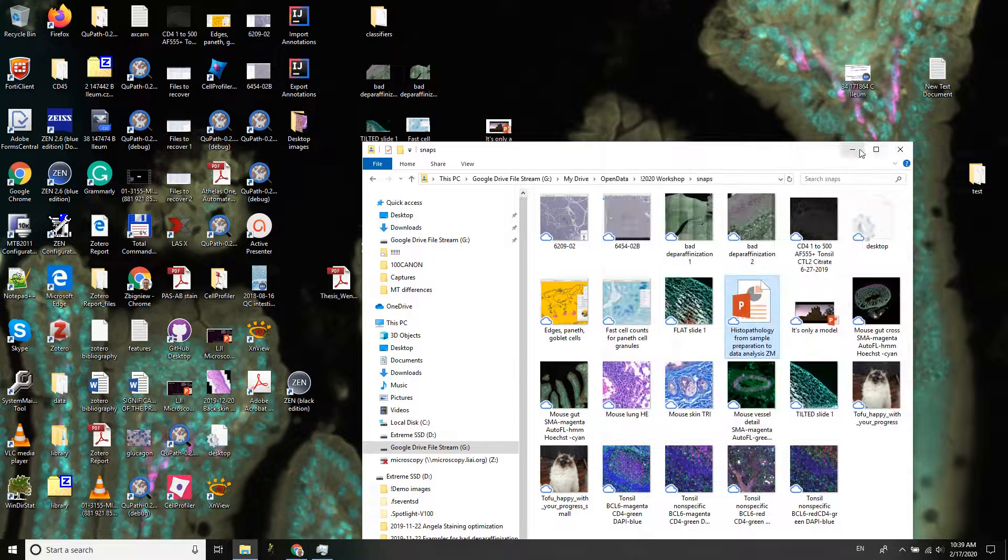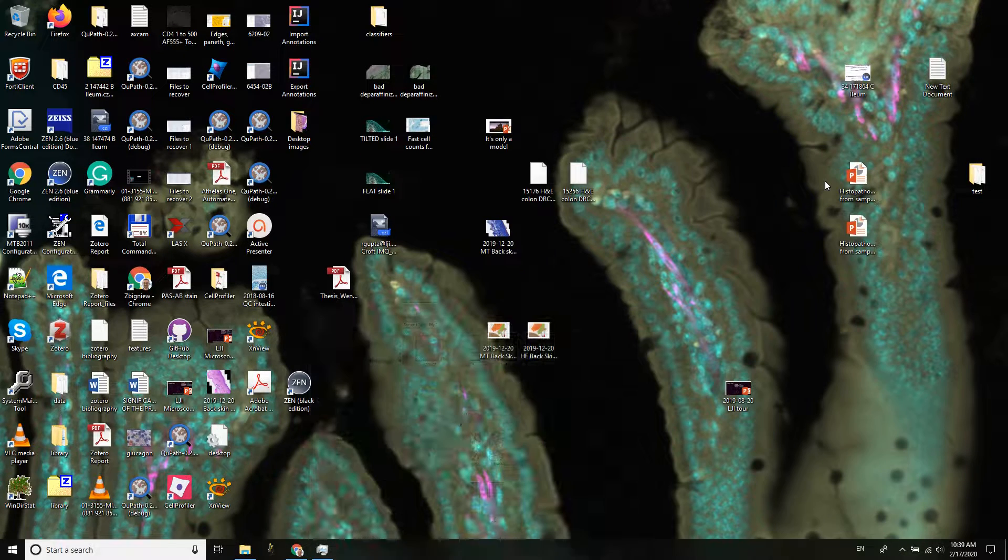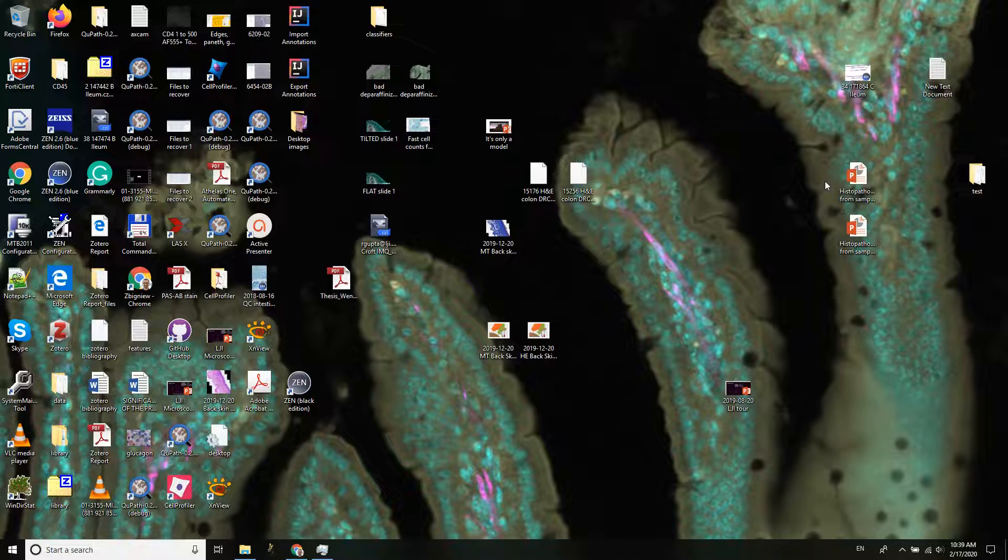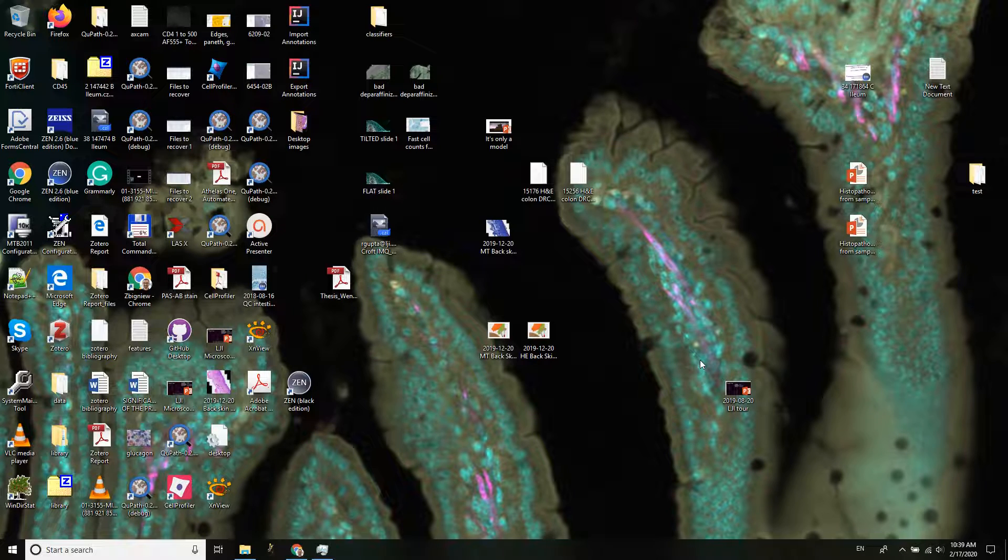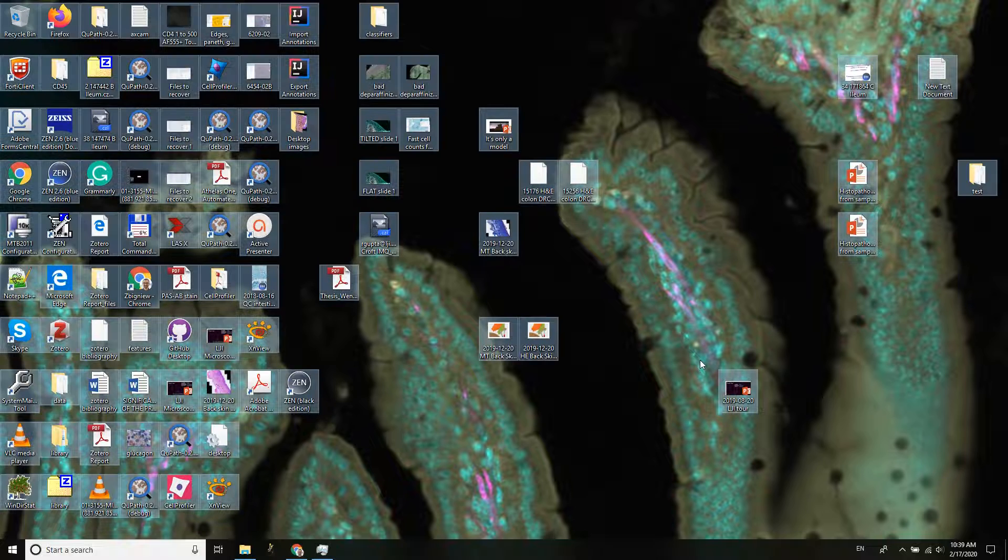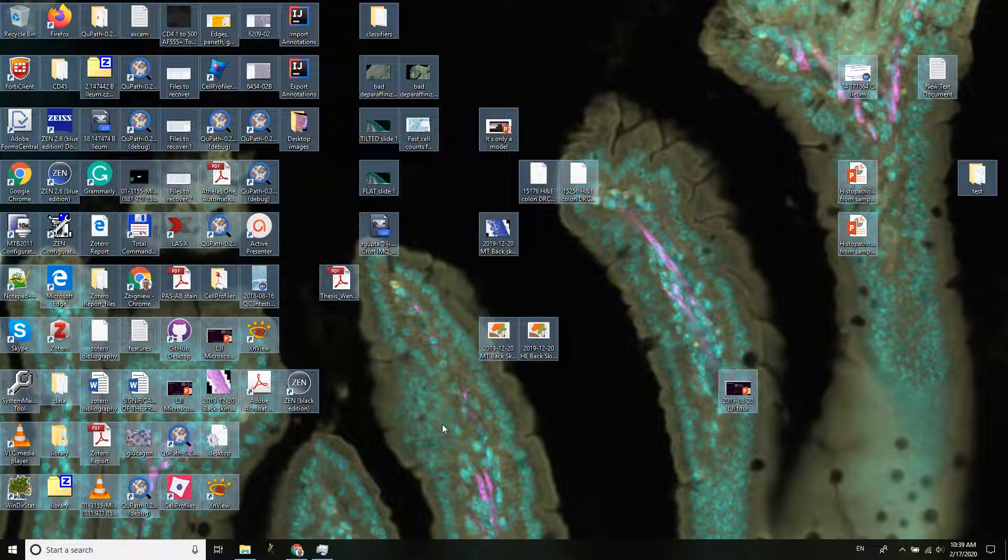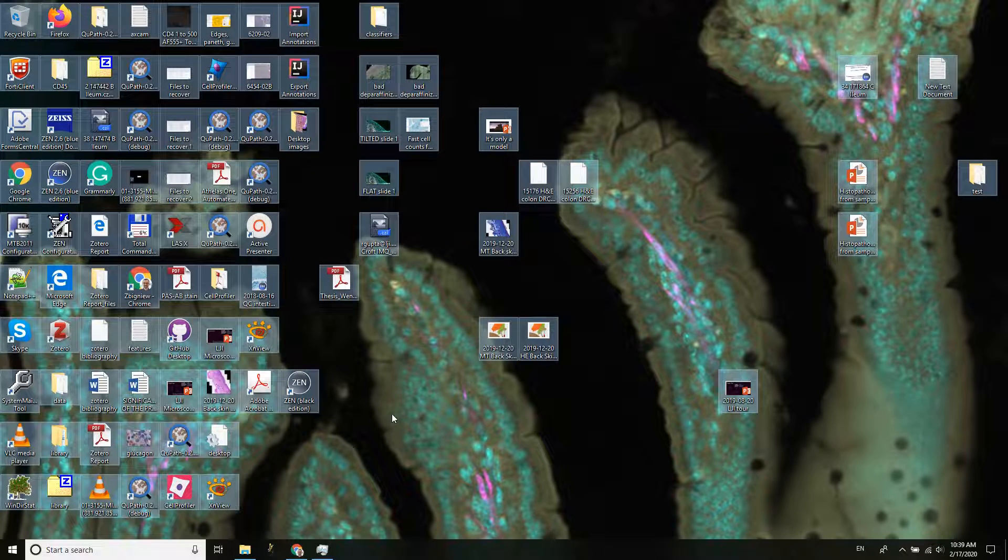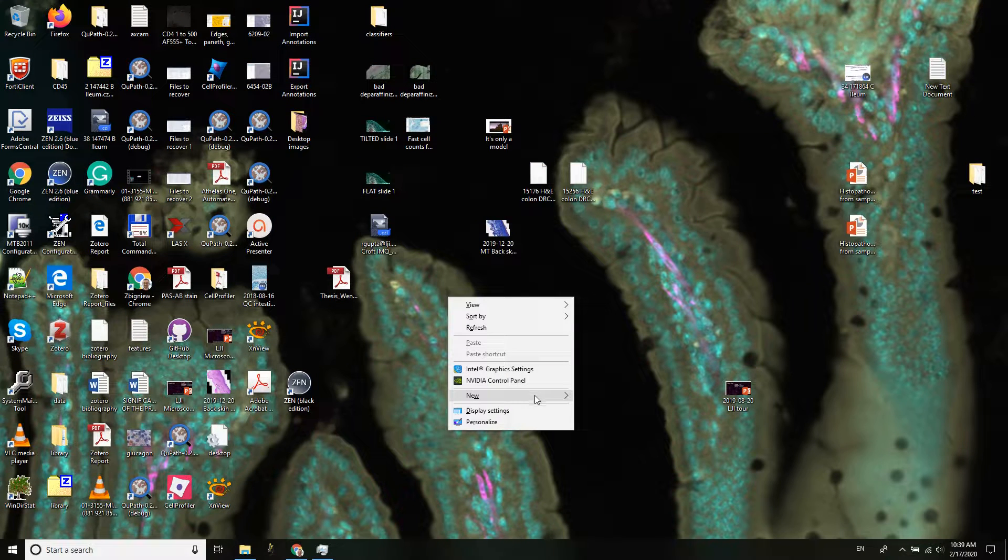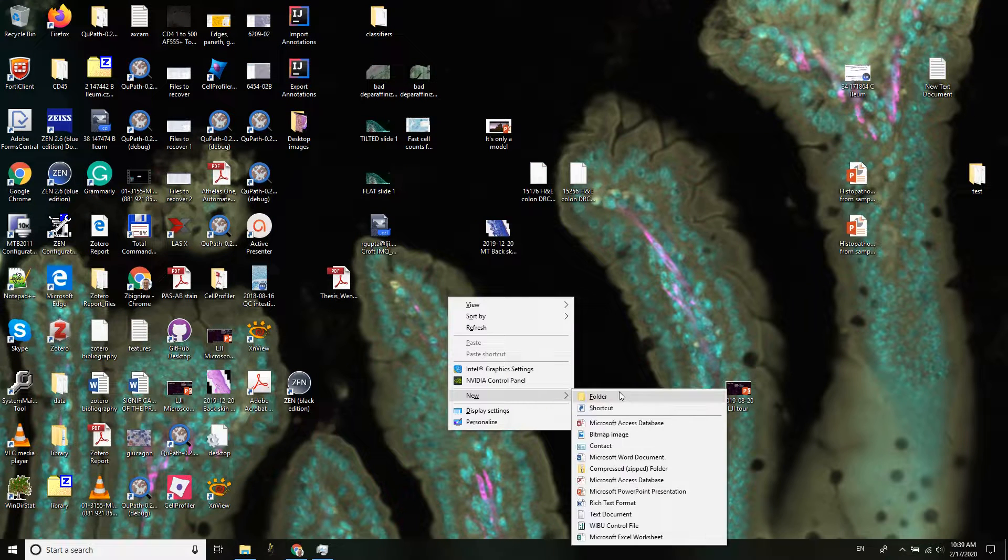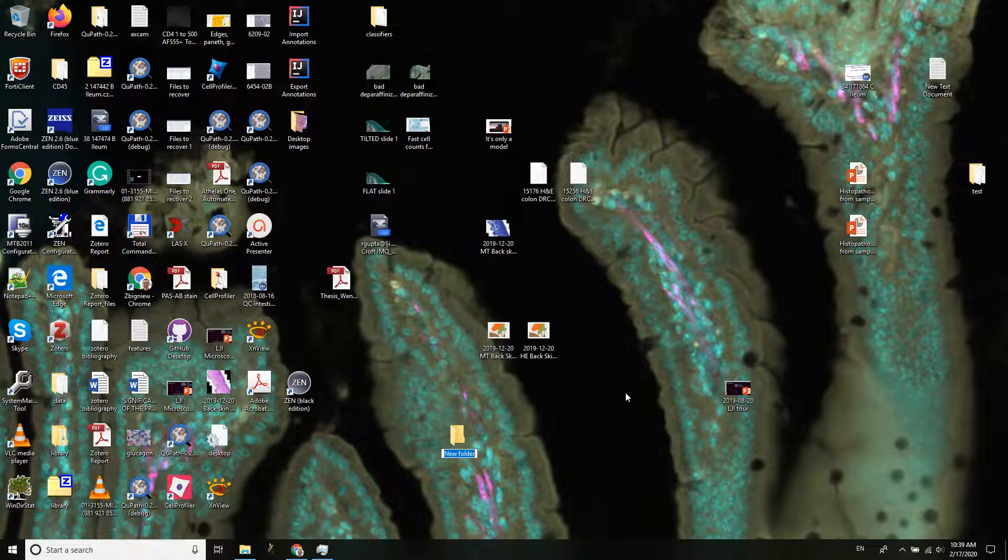So first things first, let's have a look at my desktop. I think we can all relate to this, at least in some portions of our life. It's kind of difficult to find anything here, so I'm going to do myself a favor. I'm going to mark all of this by hitting Ctrl+A and I'm actually going to make a new folder here.